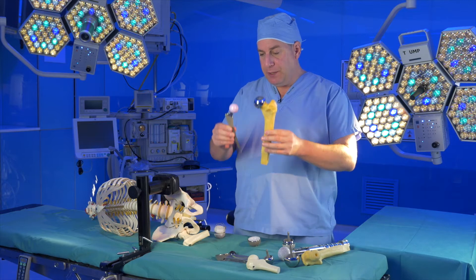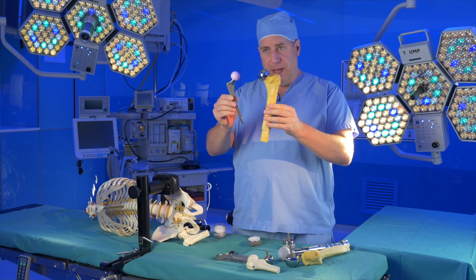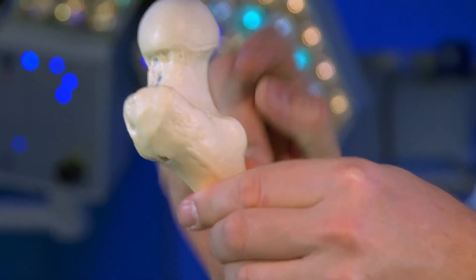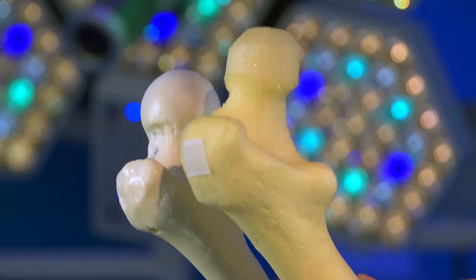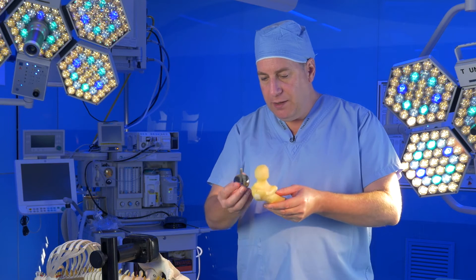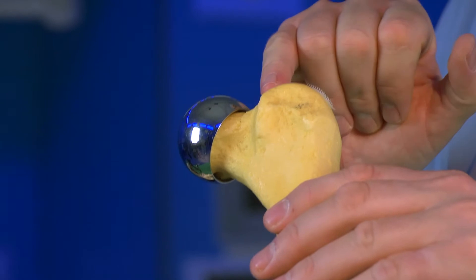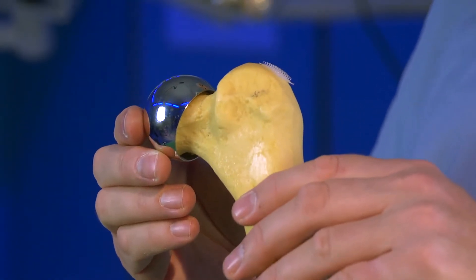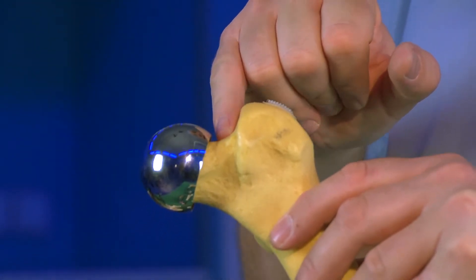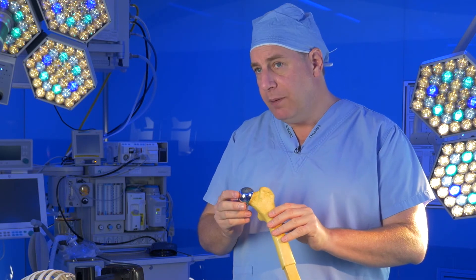In a conventional hip replacement, we replace that bone with a large piece of metal. In a resurfacing, we just take off the outer layer of bone to profile it so that the resurfacing head will fit over the top. The problem is the bone can be weakened during the procedure — this one has a tiny little notch in it from the cutting tools, and that can act as a stress riser that allows the bone to break off completely.